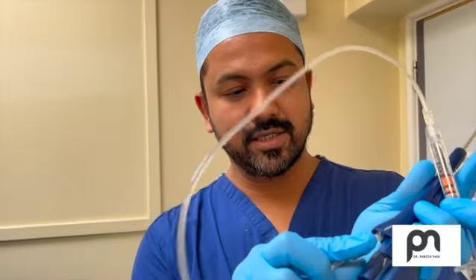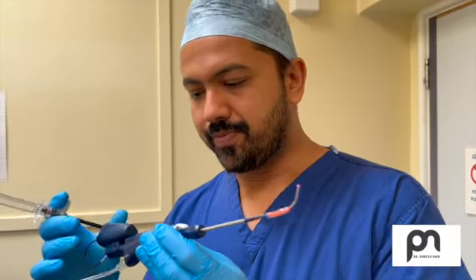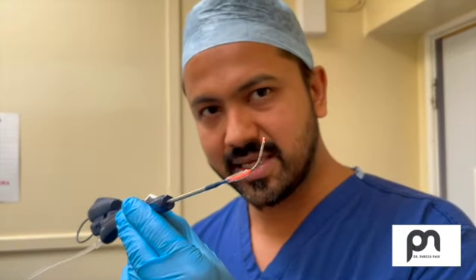Once you do that, this is the attachment for the pressure system. You attach it over there, and we have saline in this. You can see saline in this, which is used to inflate, not infiltrate, apologies. So how do we know we are going in the exact place? One of the things I like about this system is it has a light probe. Can you see this? When you go in the nasal cavity, this enters the ostium. If you go into the frontal ostium, this part will glow up. Similarly, if you're going to the maxillary sinus, this part will glow up. We know that we are in the right sinus. Also, those areas can be slightly dark, so it helps to illuminate that area and seek the ostium.